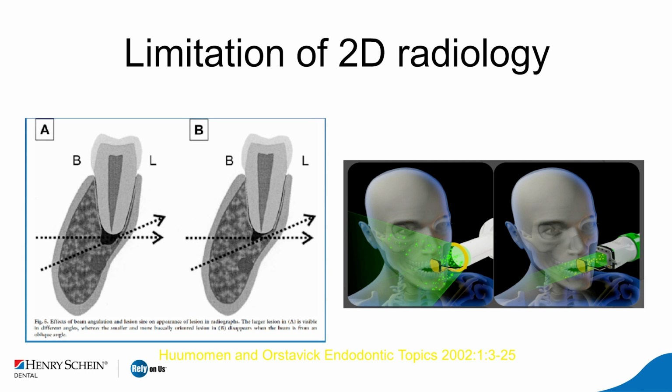I'm going to stress the fact that CBCT is not going to replace the whole imaging technology. You still need to take some intraoral radiographs, and one of the indications for that is if you want to assess, for example, decay or caries. Well, the best exam is still a bite wing for those purposes. Okay, you will still need intraoral radiographs for assessing the level of interdental bone in perio, for example.